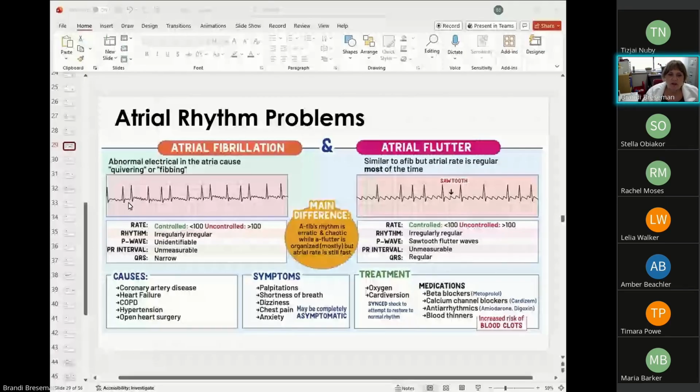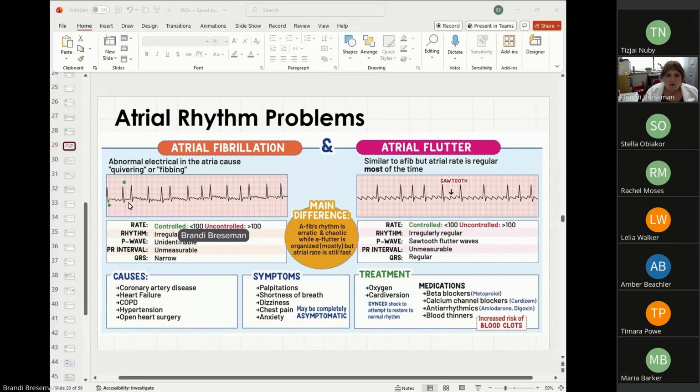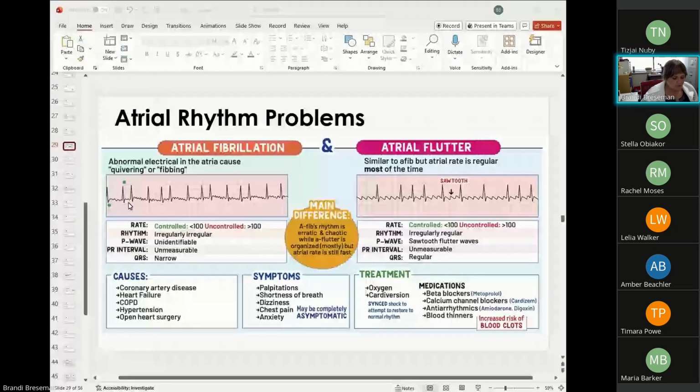And we're going to say we have one. I don't know if I would count this one on the very edge or not. I probably wouldn't because I don't have the whole complex there. So I'd probably start here and go 1, 2, 3, 4, 5, 6, 7, 8, 9, 10, 11, 12, 13. So what's my heart rate?